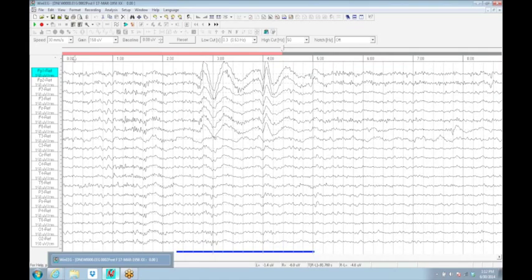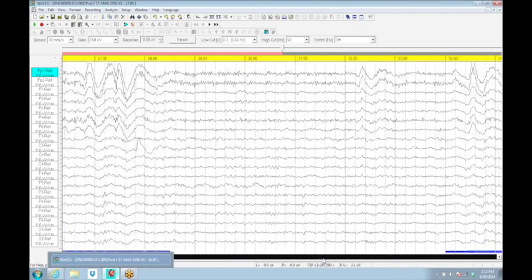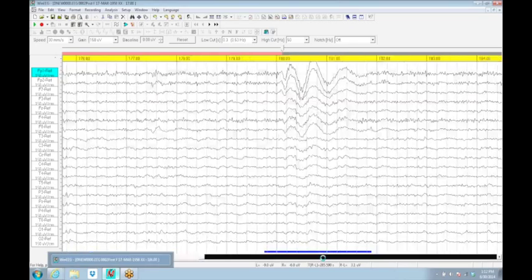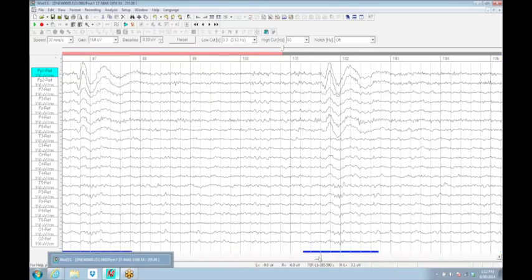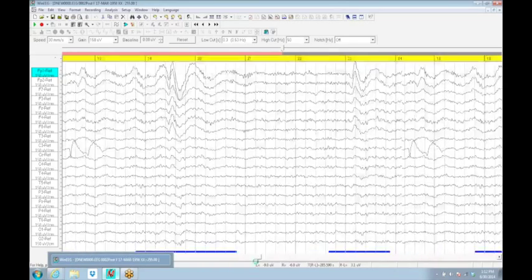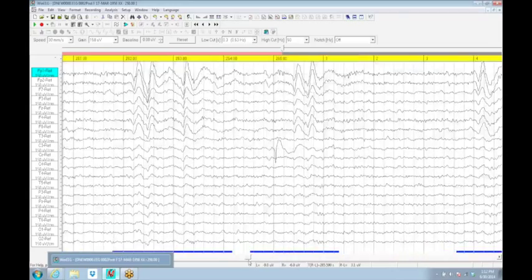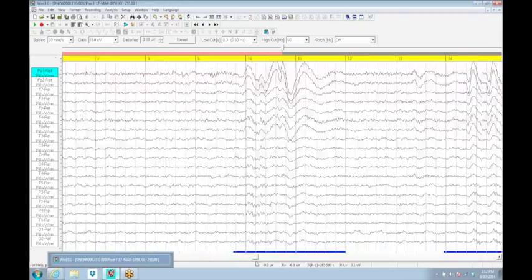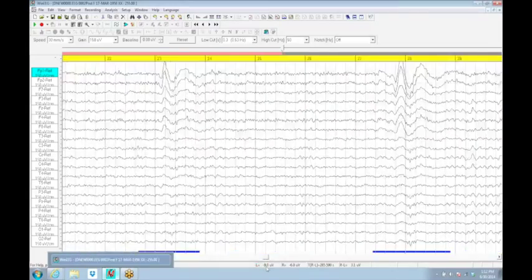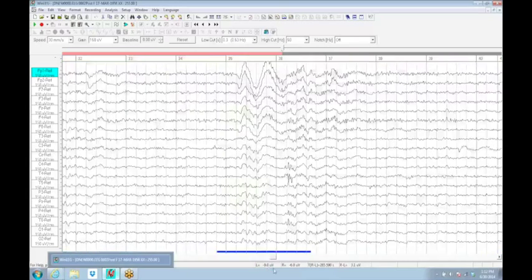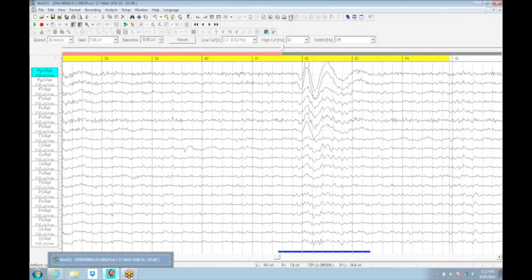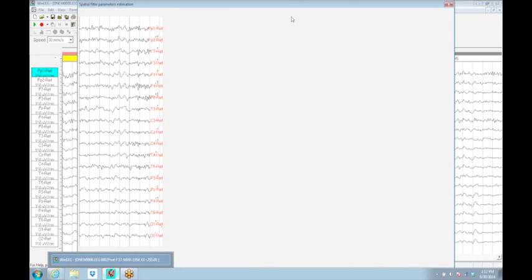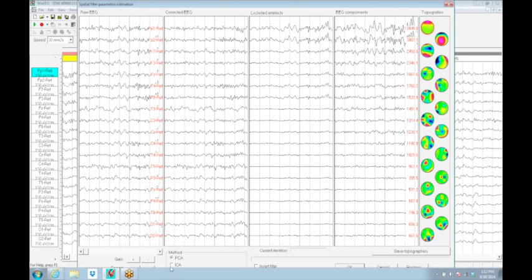Individuals analyzing for state would prefer to see intact stretches of EEG, not small atomic particles pieced back together. Instead of marking pieces and extracting them, I'm going to mark a large piece of this EEG from the beginning a few hundred seconds into the EEG. I've got a big chunk of EEG selected. I'm going to click on this. Now that I have a piece of EEG selected, this is an artifact correction algorithm.